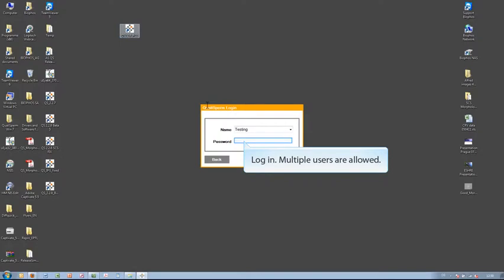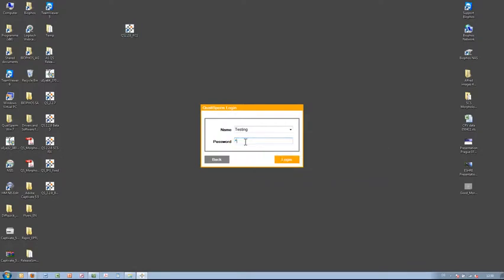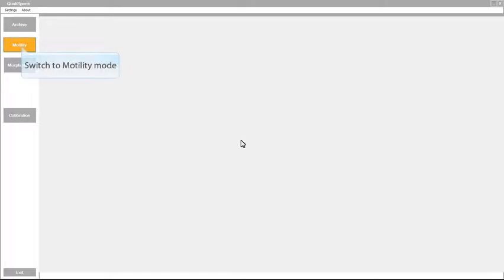Qualisperm is a multiple user system which enables login into your personal archive and measurement settings.